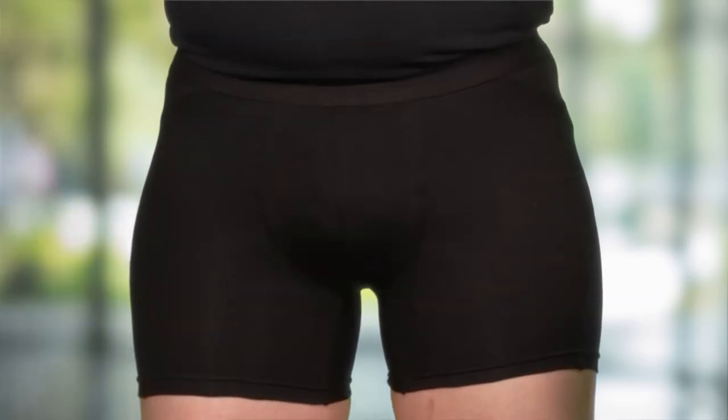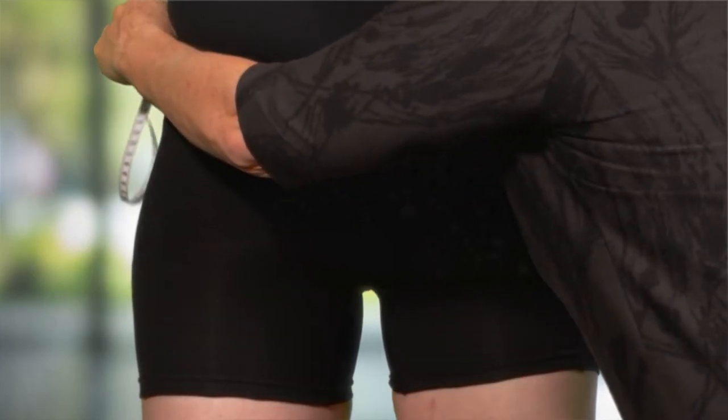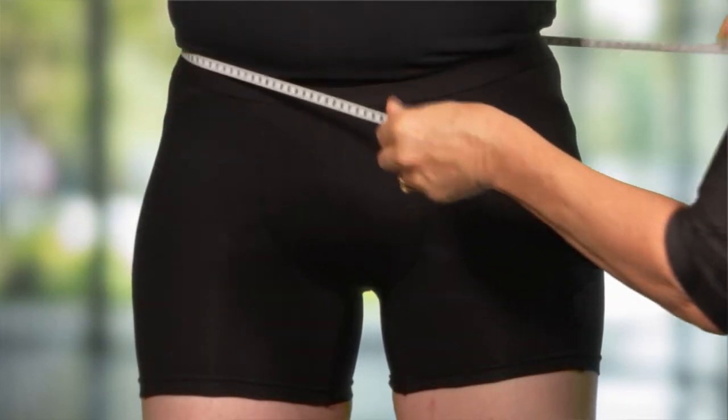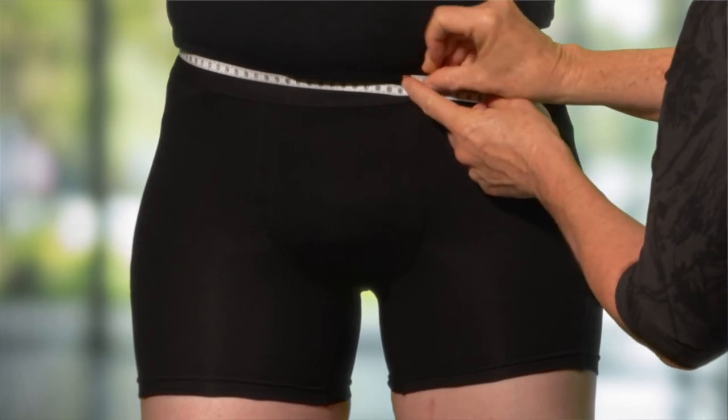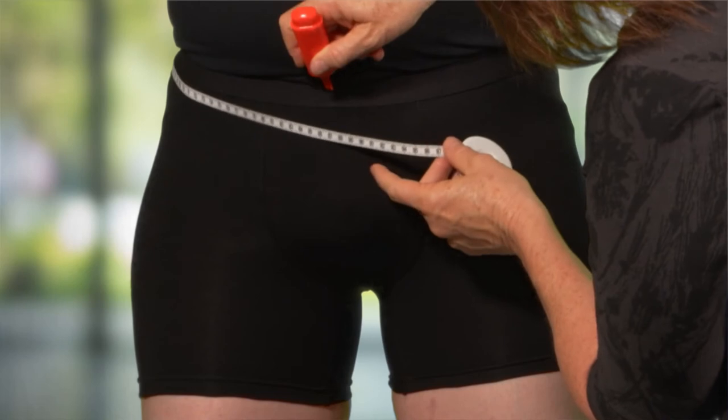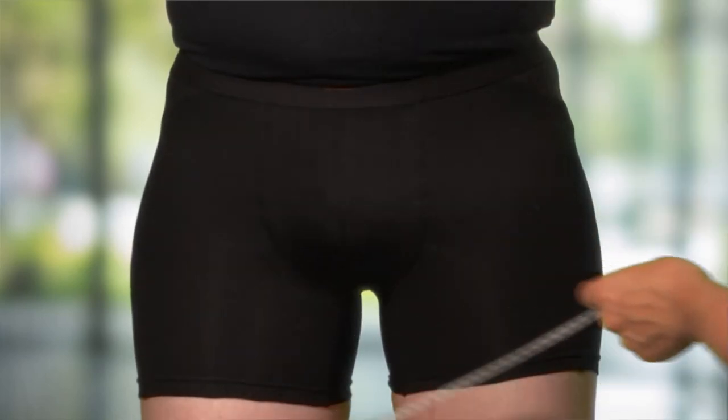The first measurement is a circumference where the top of the support will sit. This is a position of comfort for the patient and is often where he likes his pants or jeans to sit. This point should be marked with the Job skin body marker highlighter.